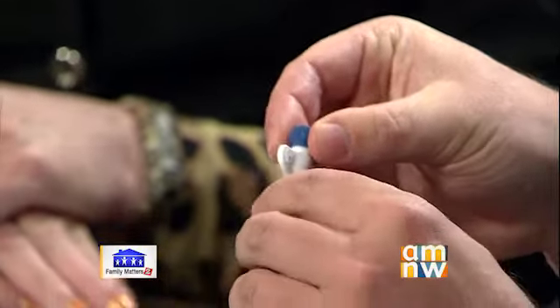Yes, so that's a different procedure that we perform, a state-of-the-art procedure known as laser ablation. So that's different than the brain movement. Yes, so that's a different procedure. Similar, it's also done through tiny devices that go into the brain, but in that case, it's actually a fiber optic cable. We do it minimally invasive, using tiny incisions, less than half an inch or so, just big enough to put these little bone anchors into the skull, and then we pass fiber optic cables through these to ablate tissue that either causes seizures or is related to tumors, things like that. But we use intraoperative CAT scans and MRIs to really perform state-of-the-art minimally invasive brain surgery.